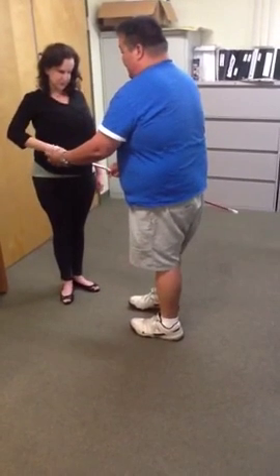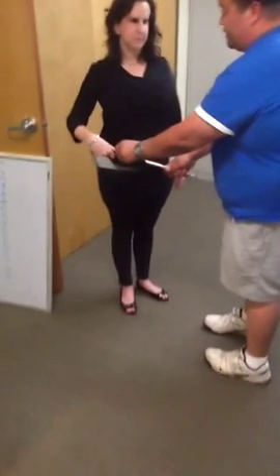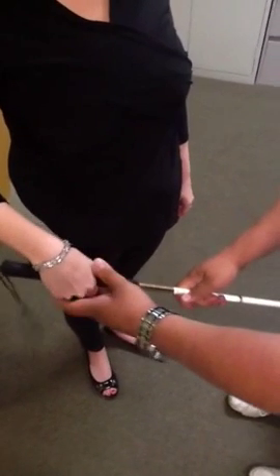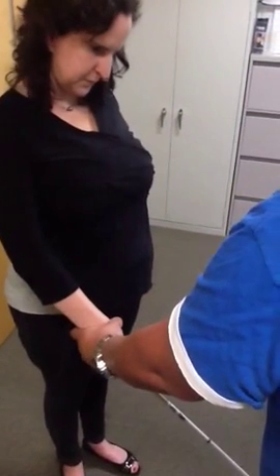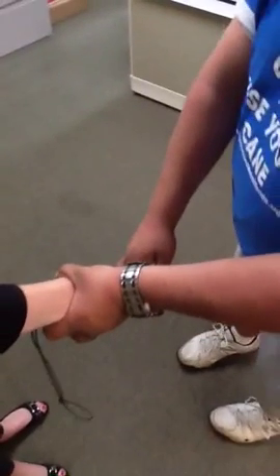Hold the grip. And the flat part of the cane, the way you're holding it now with your thumb, is one standard of holding a cane. You want to hold the grip out just a little, just like that. Okay. This is one way to hold a cane. You're going to find out that you have to find what's comfortable for you. But this is one way of doing it.